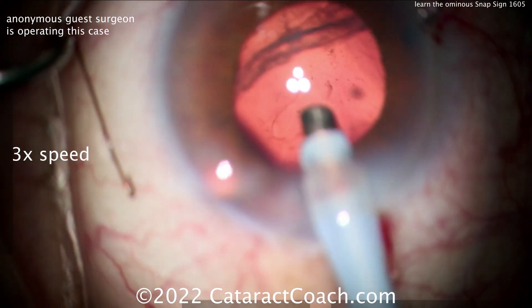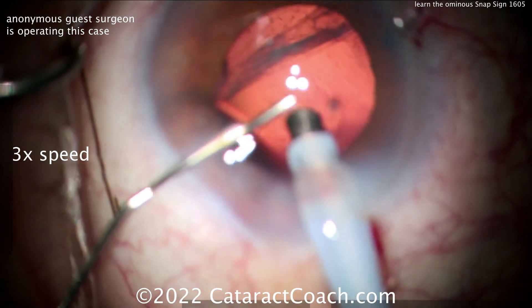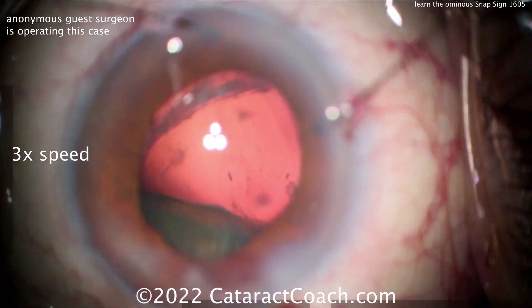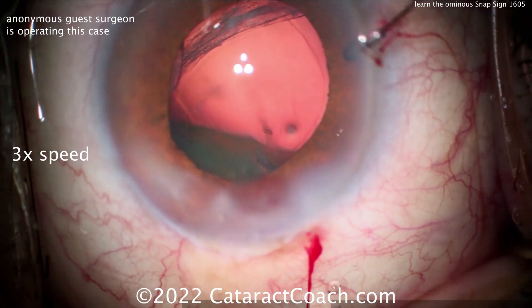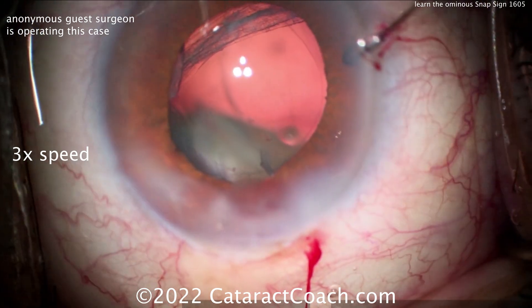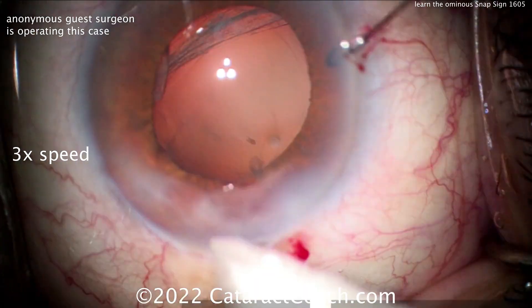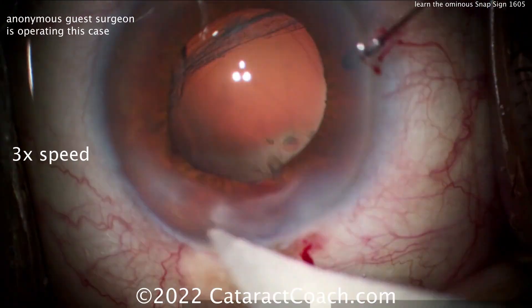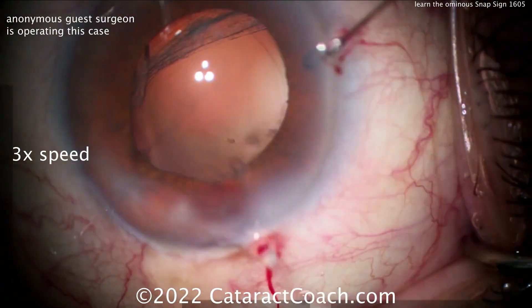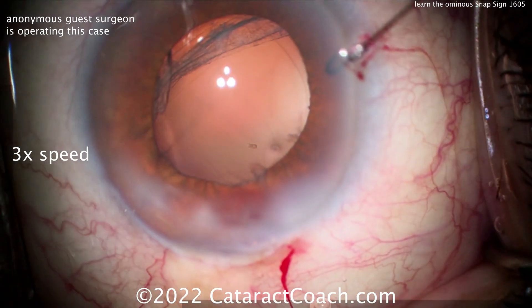Now it's okay. The patient is going to get a pars plana vitrectomy, a pars plana lensectomy. Time to just clean up the anterior segment. There's the nucleus — should you go after it? No, just let it go. Much easier to have the retina surgeon do it through the pars plana. It's already engulfed in vitreous and there's just no way to remove it through the anterior chamber. If you yank on that nucleus now, you're going to get a giant retinal tear and retinal detachment — a big hot mess.